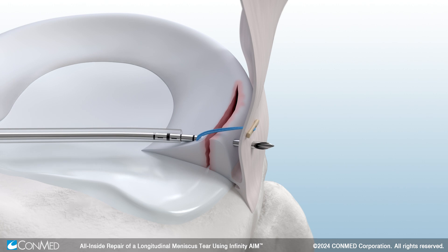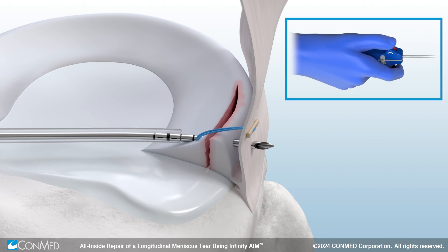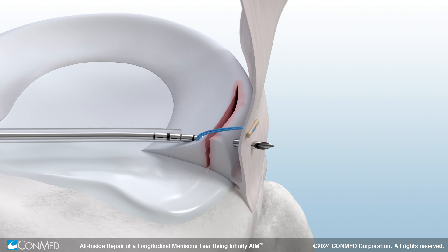Pierce through the meniscus and capsule, using the black trigger to deploy the second implant. To preserve the anatomy of the meniscus, a blunt push rod will automatically extend past the needle after the second implant has been deployed.